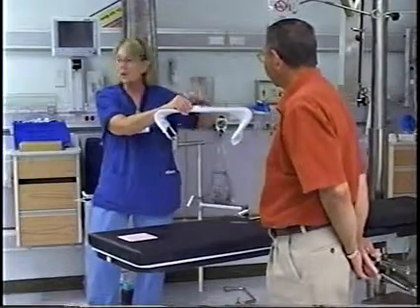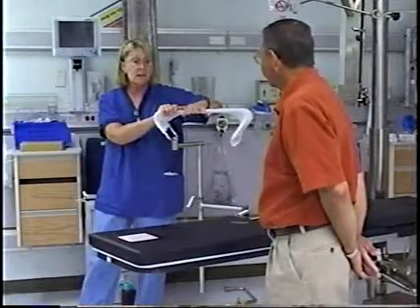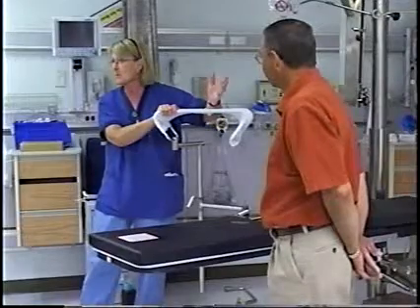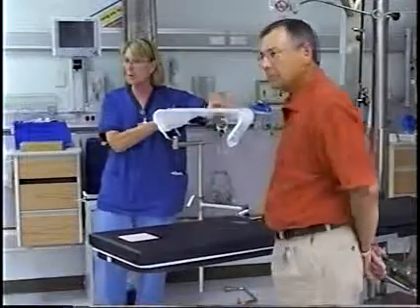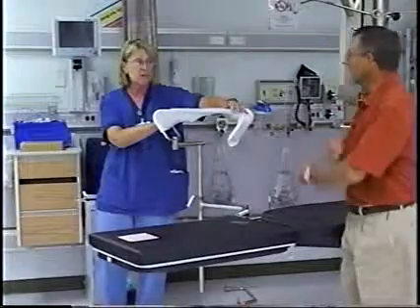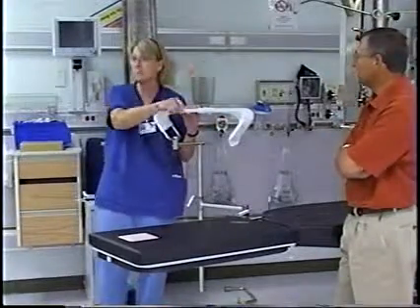Mm-hmm. And lots of our patients will come down with that yellow foam thing. A while back somebody thought, why don't we reuse it, because it's a disposable item. So if they come down with Buck's skin traction on with that yellow foam thing, put that in here. Put it right here. That's another source of support and foam for the foot. Then just take your ACE wrap and wrap it up.